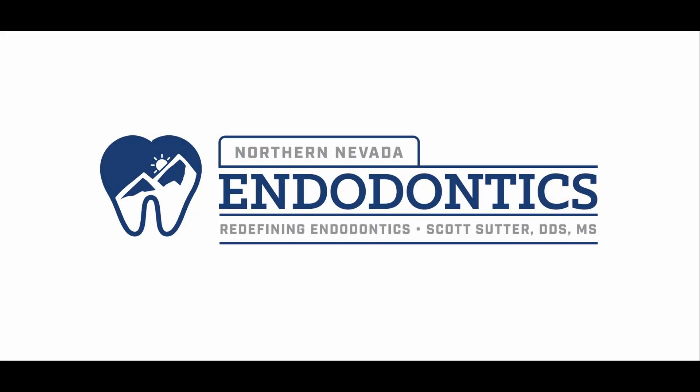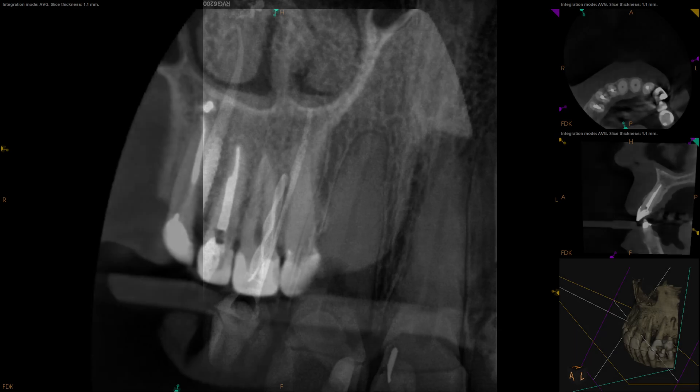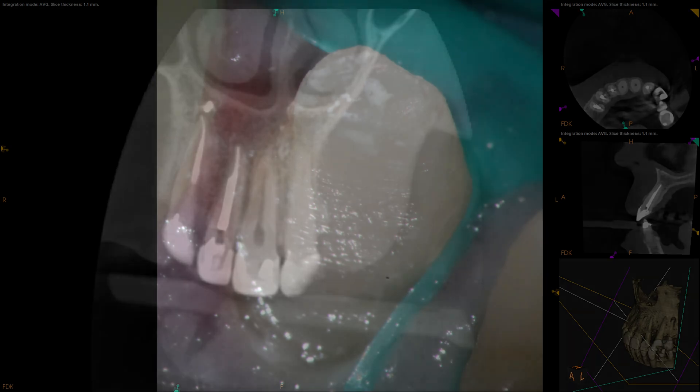Hello everyone, and welcome back. This is a fun one today for sure. I haven't seen this one before. That, ladies and gentlemen, is a post drill that broke off inside the tooth. You can see it's pretty straight, with a little bit of a ledge that was created there. But how did this happen? Well, we'll get into that.